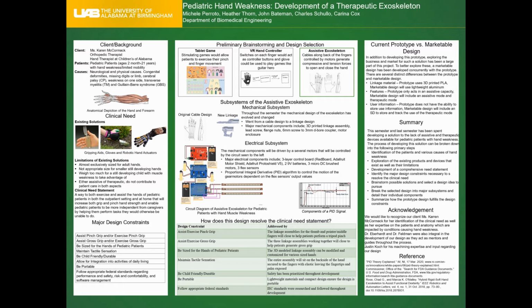In order to answer the question, how does this design resolve the clinical needs statement, each design constraint was reviewed and assessed as to whether or not it was addressed by our solution. The results of these assessments can be seen in the figure below.